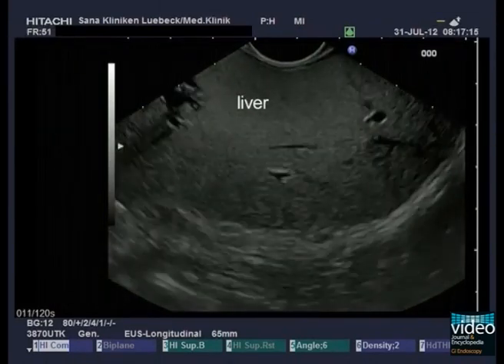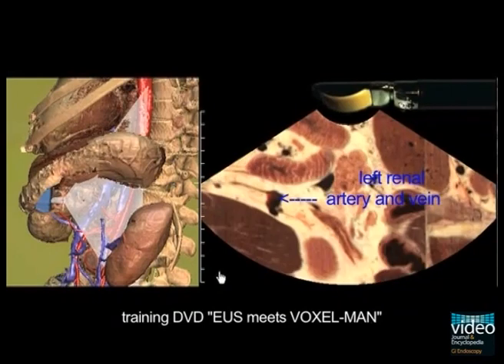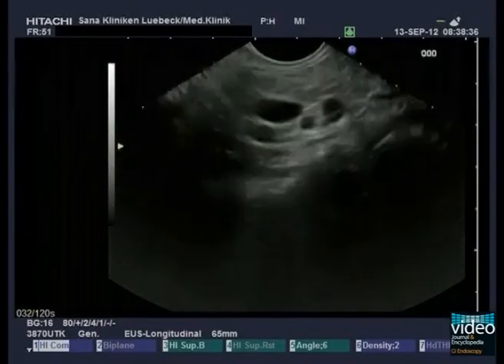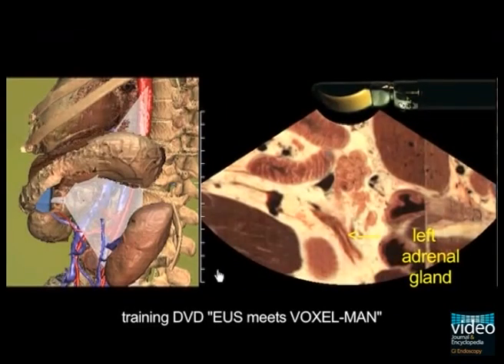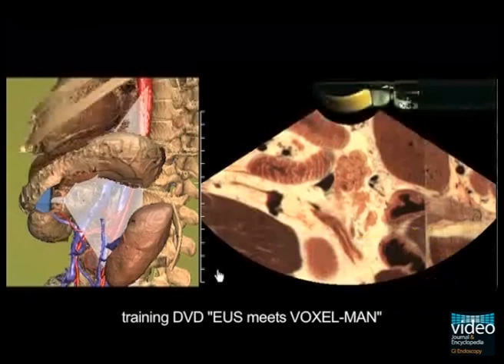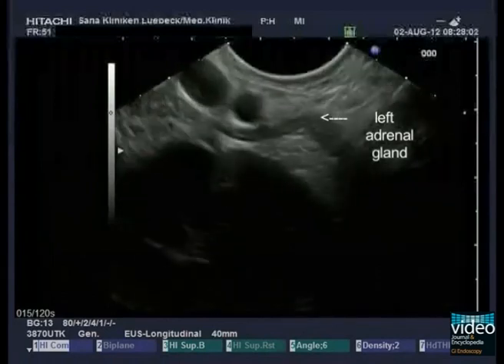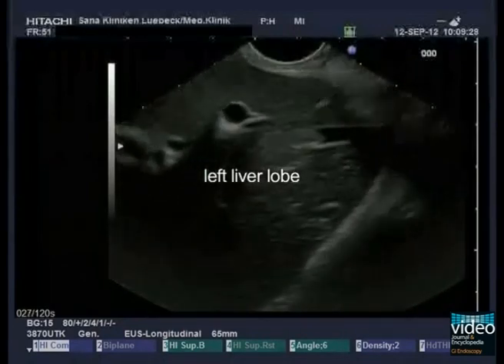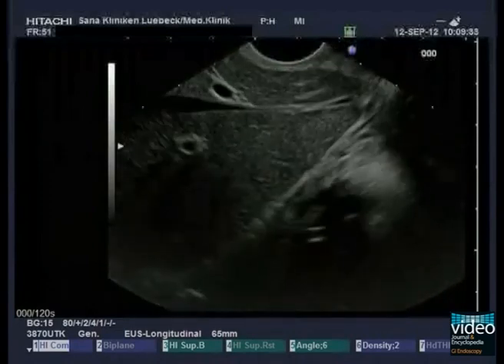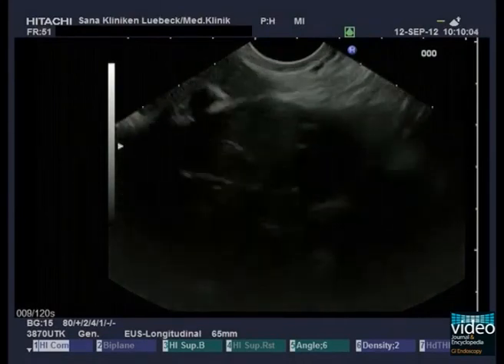The transducer is now directed ventrally. On the turn back to the aorta, it is possible to see the origin of the left renal artery together with the vein, and they can be followed into the renal hilum. In between the cranial pole of the kidney and the aorta, the left adrenal gland appears. In the ventral position of the anterior gastric wall, the left liver lobe with segments 2 and 3 can be seen. By a rotation to the left, the intrahepatic veins can be followed into the inferior cava vein close to the diaphragm.